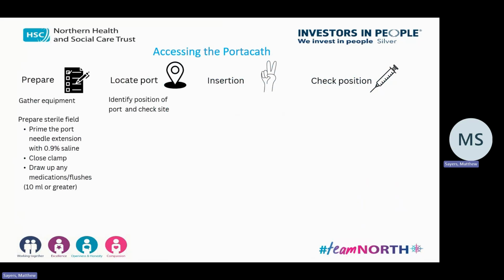Now, I have seen a video that actually says once you have found the point, some people put a little Clinell wipe almost as a pointer above it to say it was here, so you don't have to keep messing with it again. That's a tip. I've never actually seen anybody do that, but I'd say, oh, that's beautiful, Lisa. Beautiful.